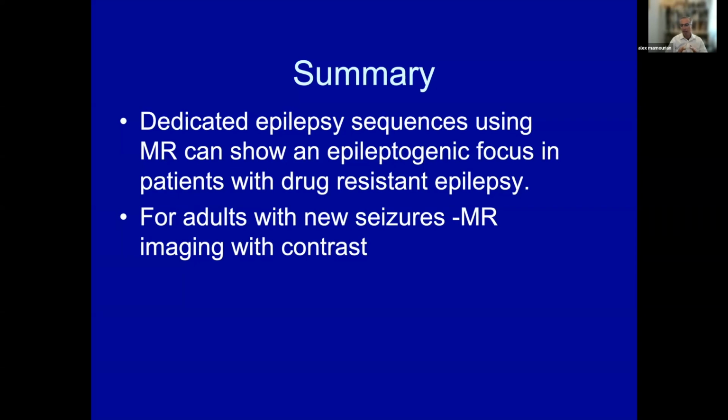And as I've touched on here, there are a broad variety of causes of seizures, and there are some things that are commonplace in imaging that when they occur in patients with epilepsy can be mistaken as a cause of seizures. So I want to make you aware of some of those so you don't overemphasize them in your reporting.